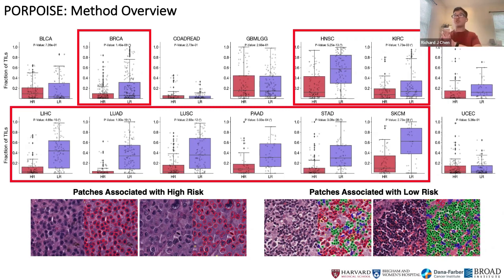The model ingests the entire whole slide and finds prognostic information on its own, and it just happens to highly attend to tumor immune cells in lower risk patients. So this is potentially how we could use multimodal learning to elucidate novel image-omic biomarkers.